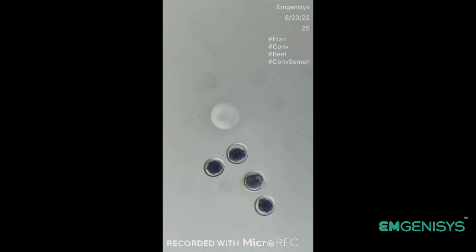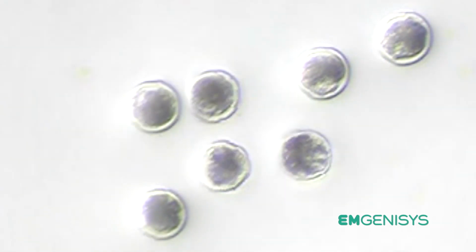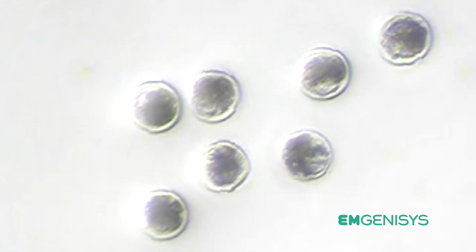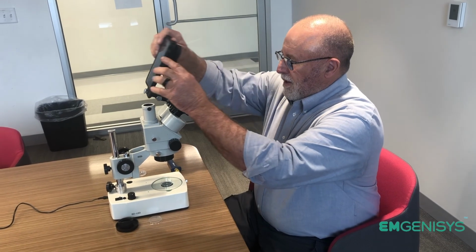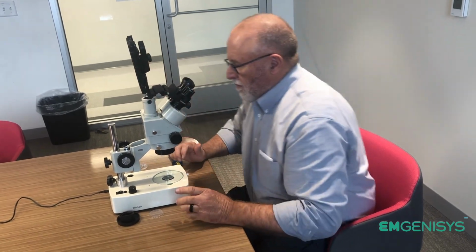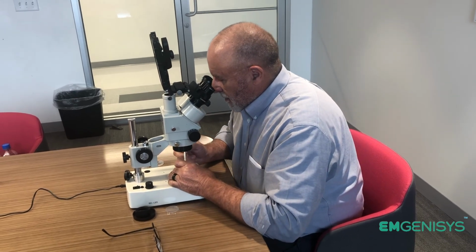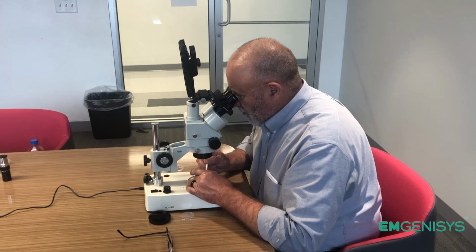This method can effectively identify embryos which are infertile, have stalled in development, have significant cellular fragmentation, or extruded cells, but it cannot relay information pertaining to morphokinetics, which are known important factors relating to an embryo's health and viability. To gather further information regarding the embryo's morphokinetic activity, such as development rate, metabolism, and stress, we will use the EmGenisys evaluation to scan each embryo for signs of life.